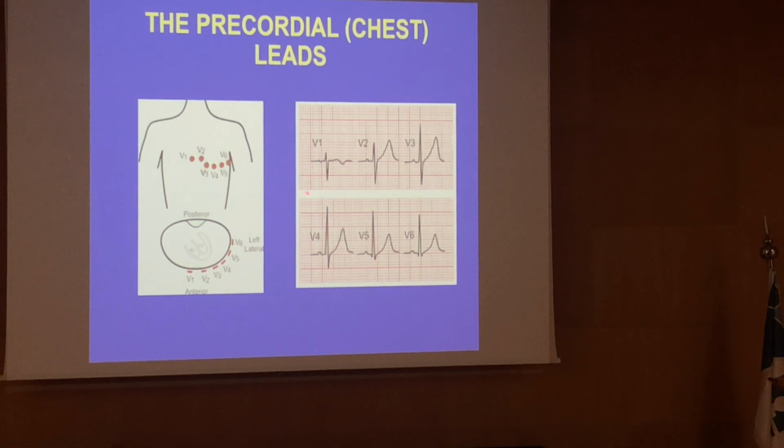When it activates the left atrium, it is moving away from V1, so I have negative deflections. That's the second part. So most of the time, commonly we see the P wave in V1 positive then negative. Positive is right atrial activation, negative is left atrial activation. And it is small like this, not huge. When it is big, we will discuss left atrial enlargement and others, inshallah, in the third year.